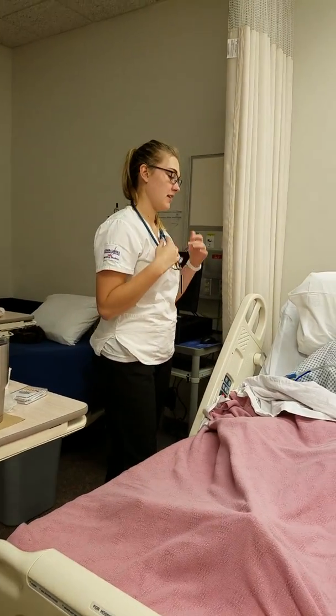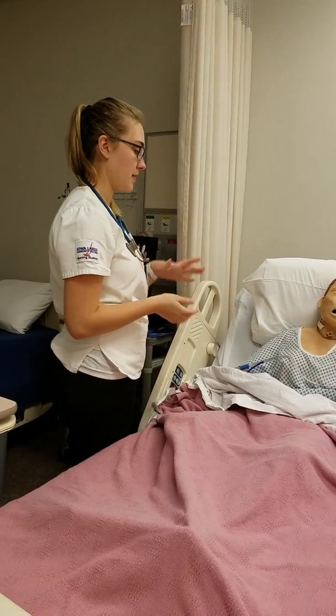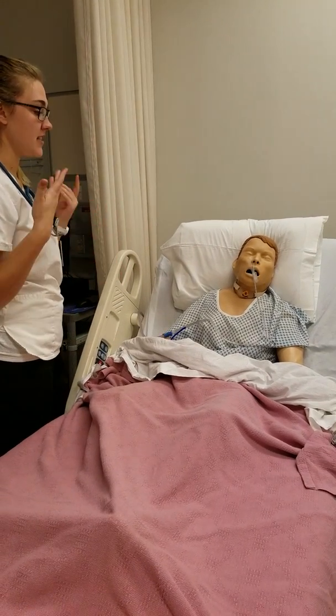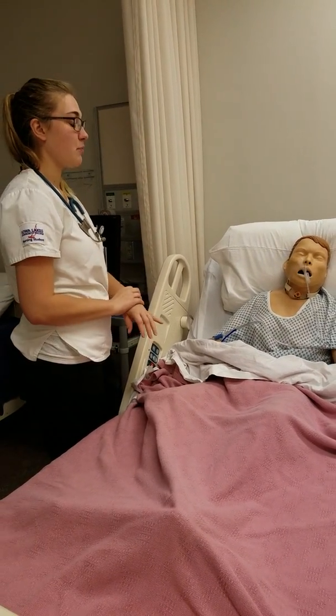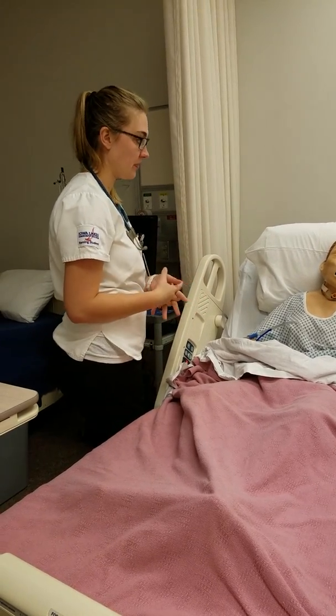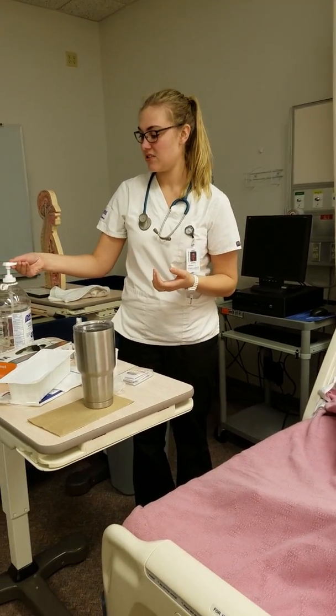And now I'm going to explain to you what's going to happen. I'm going to put on my gloves. I'm going to take out your NG tube. And during this time, it's important that you take a deep breath and hold that breath. And I promise it's going to be a lot more comfortable than when it went in, okay? So now I'm going to perform hand hygiene.